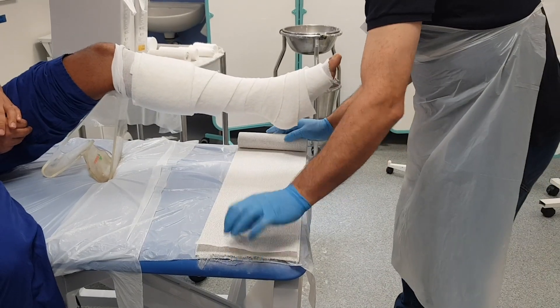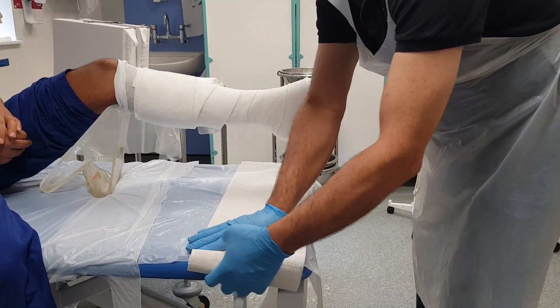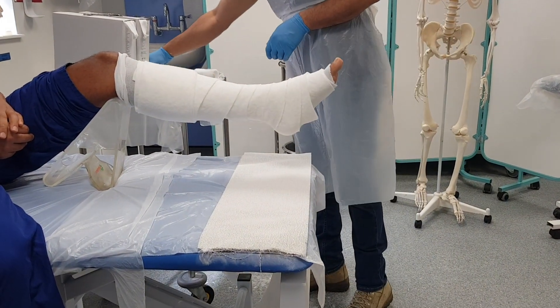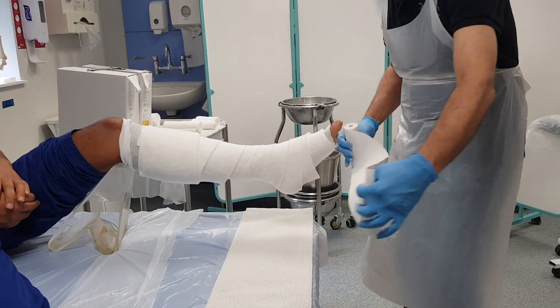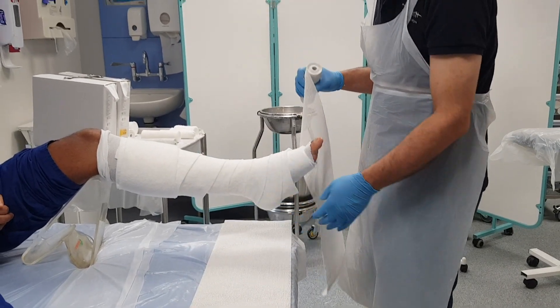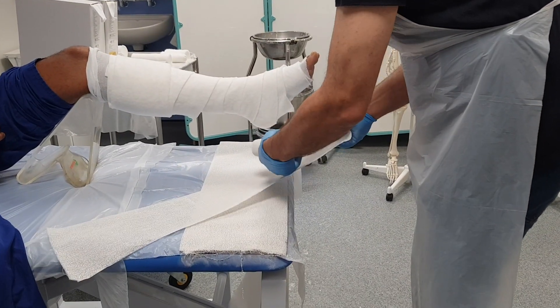I'm going to create six layers for the main slab. Then I'm going to create a U-stirrup as well — for the stirrup I'm going to use six-inch plaster. That's just going to go around the ankle because the weak point in this plaster is always going to be the ankle, so I'm going to reinforce that with my six-inch stirrup — six layers.